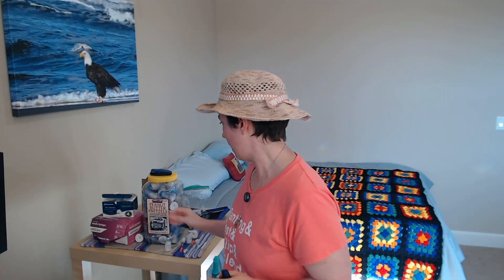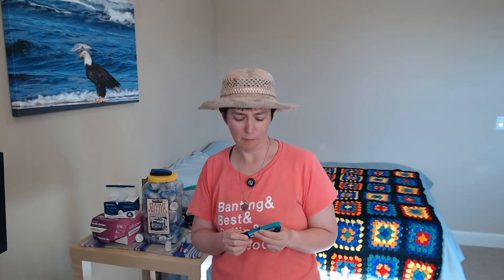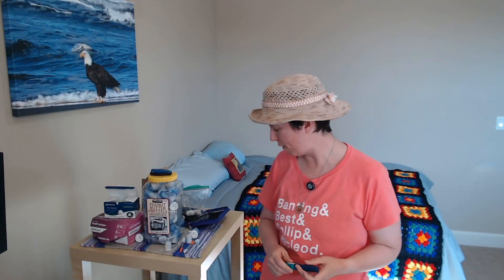Insulin pens are reusable — they have a bunch of insulin in them, so they don't come with a needle on top. You have to get pen needles, a box of pen needles, which will usually be prescribed separately, and you screw the pen needle onto the top of the insulin pen. So whether you're using insulin pens or insulin syringes, you have a needle on the tip that you need to dispose of safely.